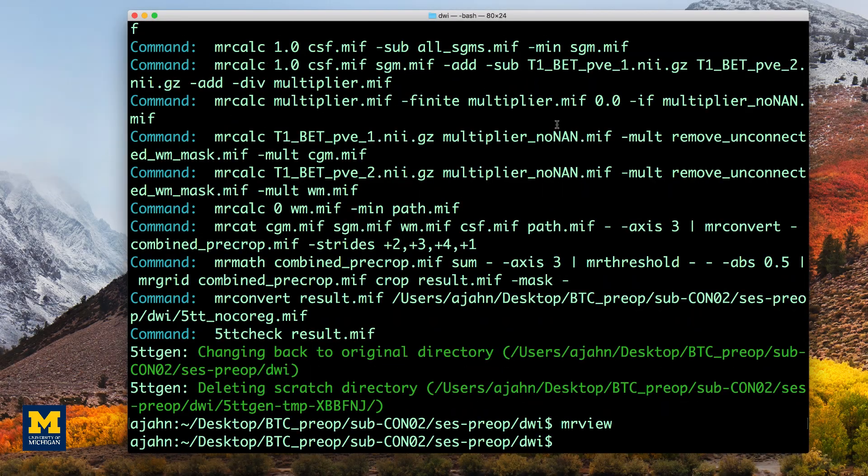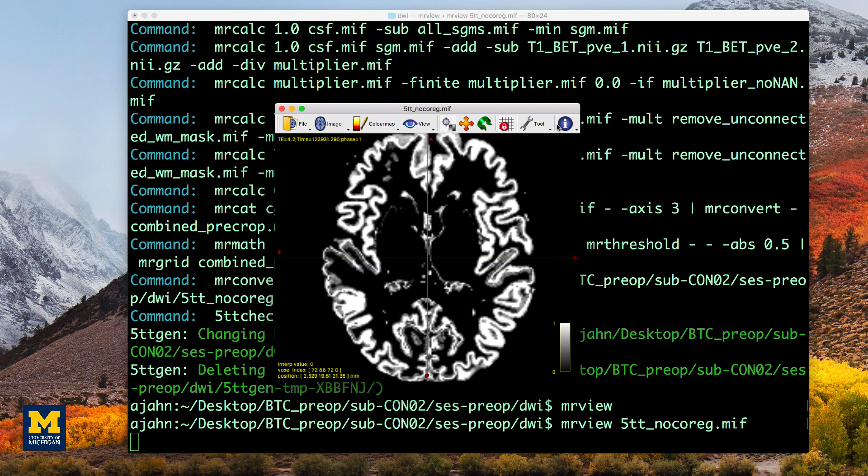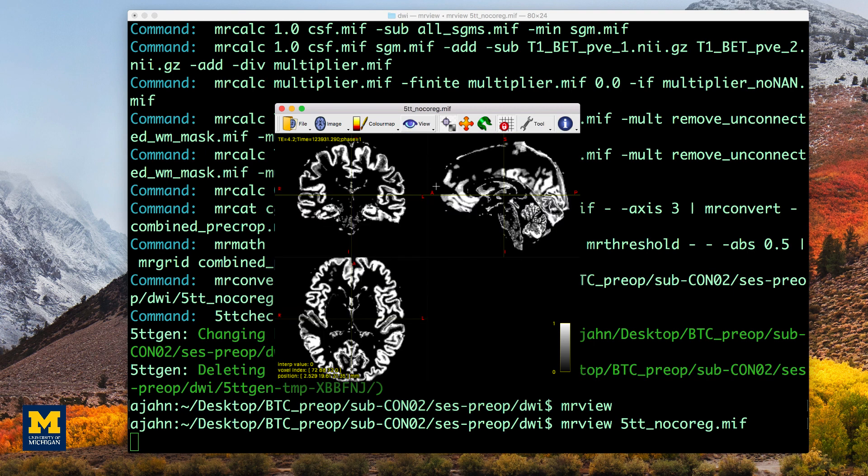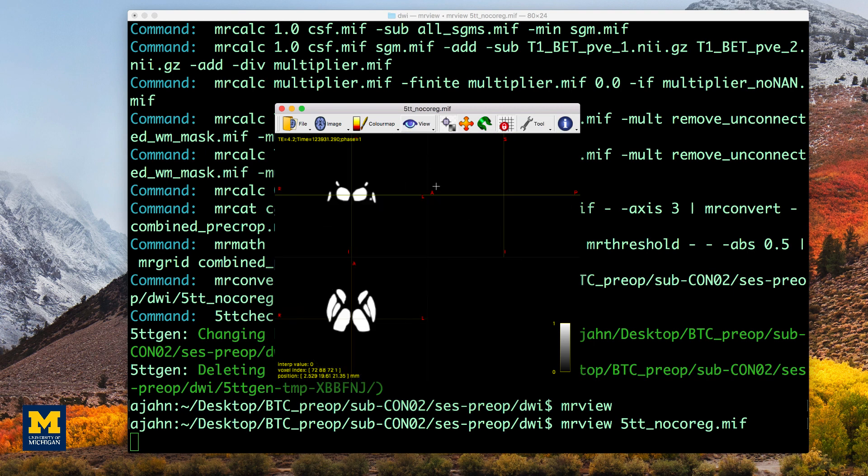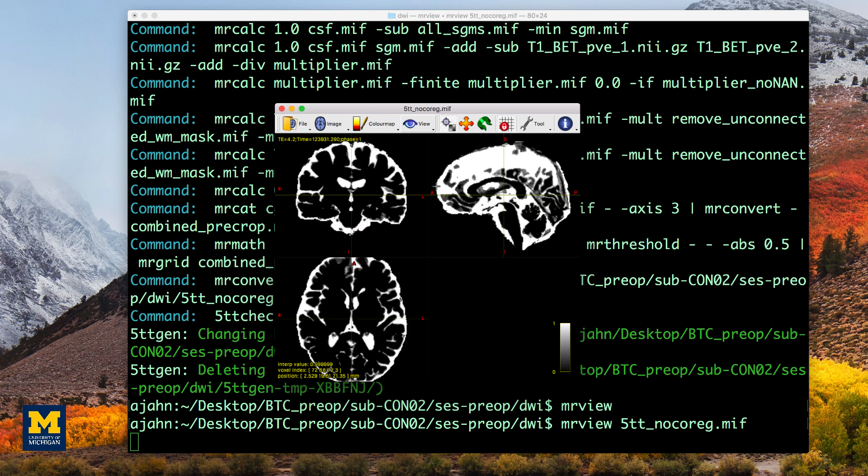If the segmentation has finished successfully, you can look at it in mrview by typing mrview 5tt_nocoreg. Press the left and right arrow keys to see the different tissue types such as gray matter, white matter, and CSF.